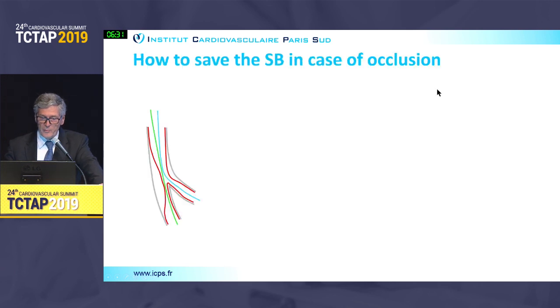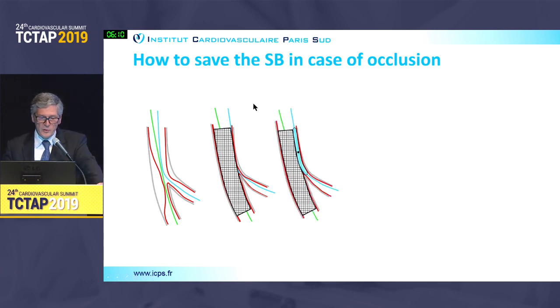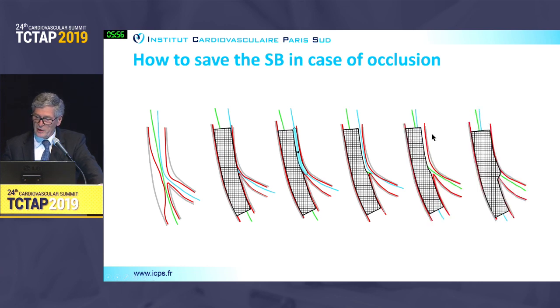So this is a very important point. And this is an example of how to solve this issue of occlusion just because you use a stent which is too big. So this is a case where you put a stent according to the proximal reference, you push the carina and you close the side branch. And if you are not able to reopen the side branch, you can use a wire which is outside of the stent with a small balloon to reopen the vessel, to have a flow in the side branch, and then you will be able to find the side branch from the main branch stent. And then you can do kissing balloon inflation, POT after kissing balloon inflation, and you may end with a very good result with only one stent.